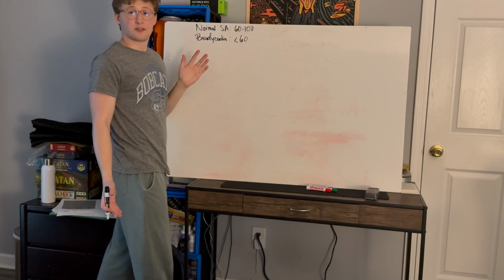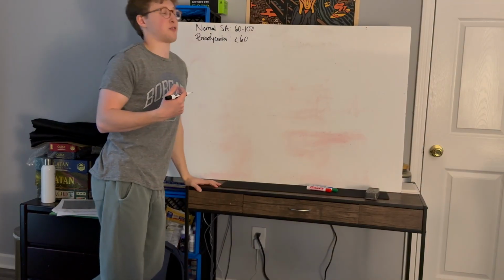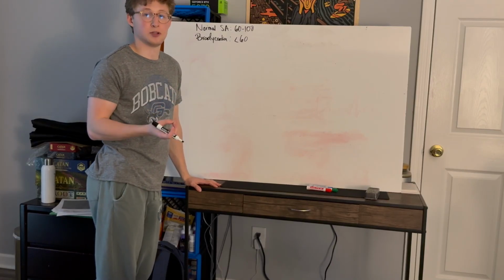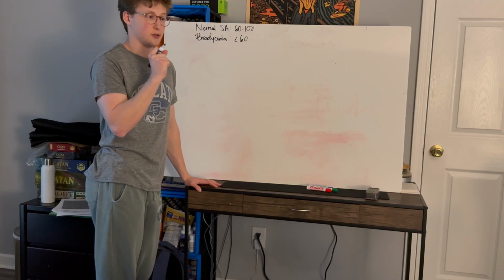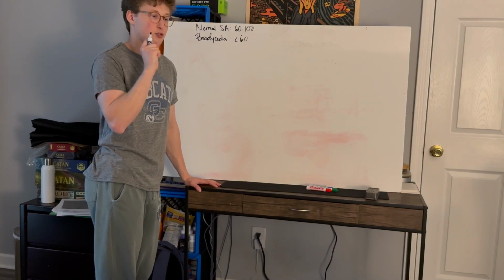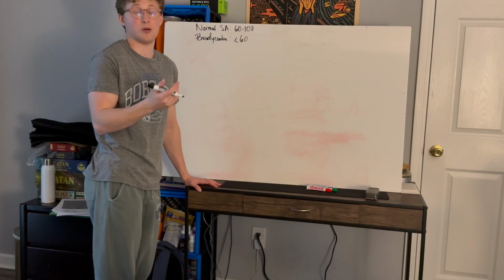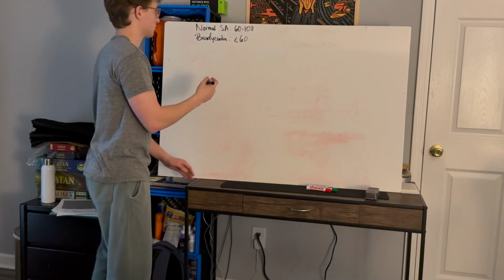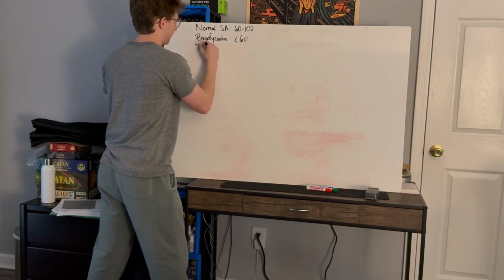maybe it's electrolytes, maybe it's the fact that they're sleeping, maybe it is certain medications that were given, maybe they're in extremely good cardiovascular shape, and so their sinoatrial node is firing at a much slower rate than normal because it doesn't need to, or because something's going on that is causing it to do that. So we have less than 60 beats per minute. And then we have tachycardia.